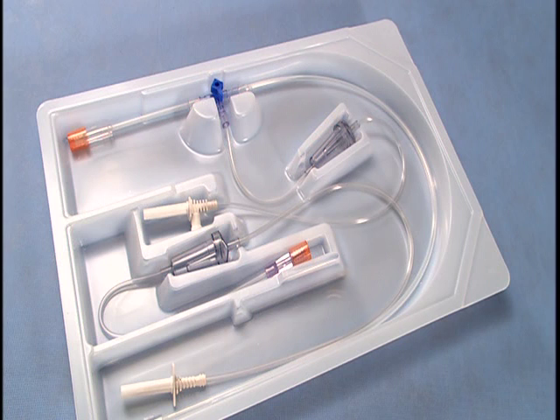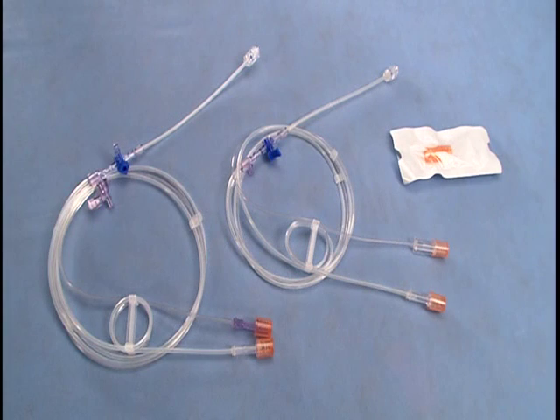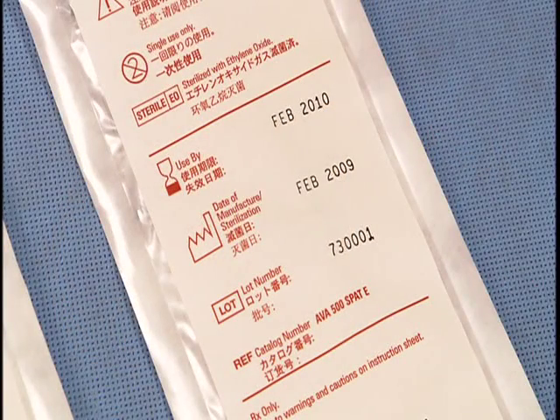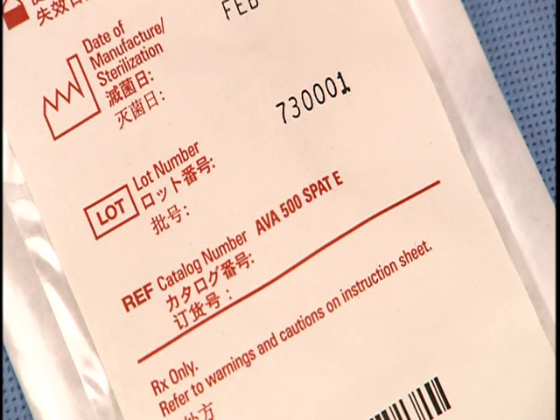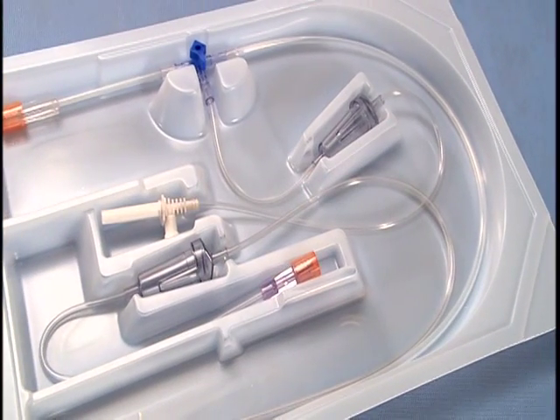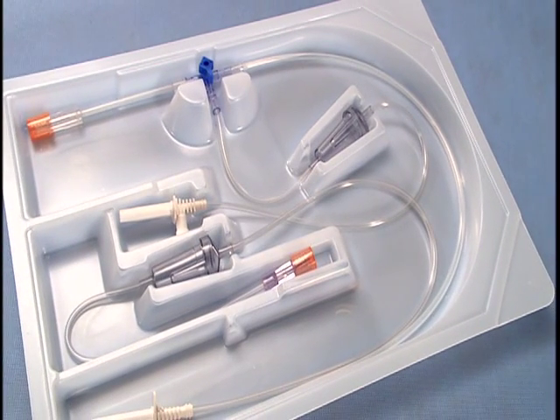Disposables for the Avanta fluid management injection system utilize both multi-patient and single-patient disposable sets. All packaging indicates the lot number, shelf life, catalog number, expiration date, and intended use of the disposable set. All Avanta disposables are latex-free and DEHP-free. Multi-patient disposables, or MPAT, can be used for up to 5 patients.